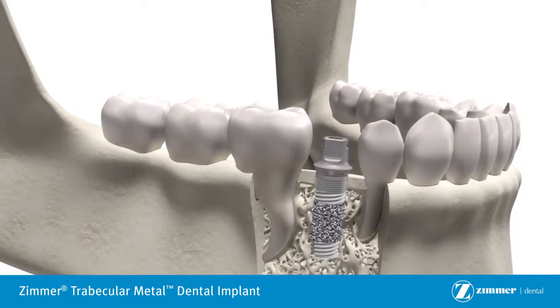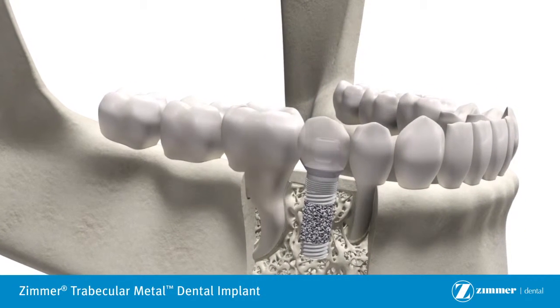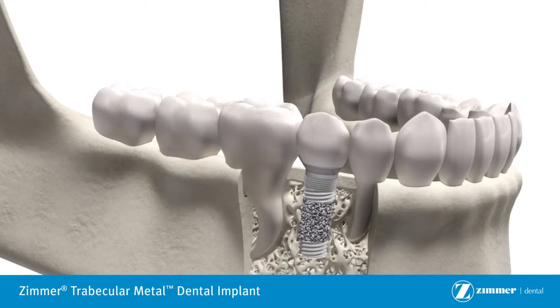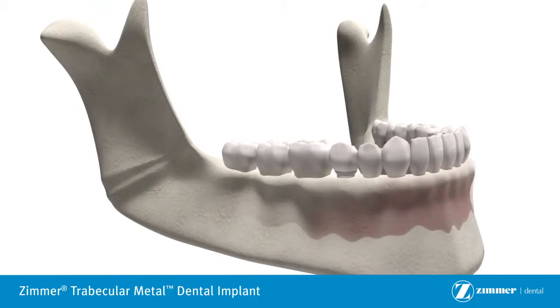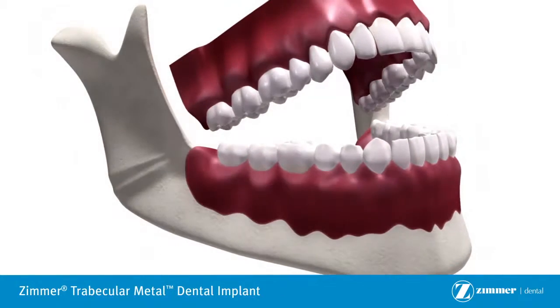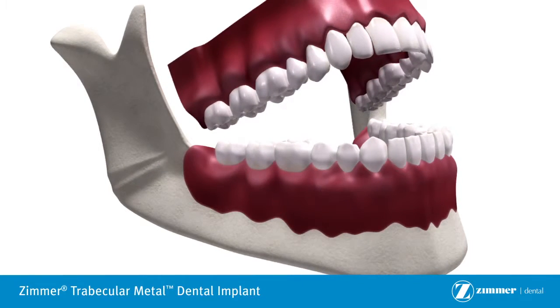Trabecular Metal Dental Implants create the potential for final tooth replacement within two weeks after implantation when good primary stability and an appropriate occlusal load is achieved. The implant may also be restored in the three to six months needed by a traditional dental implant protocol.